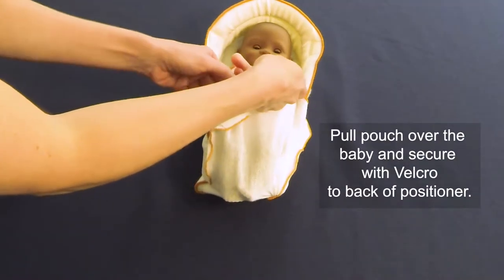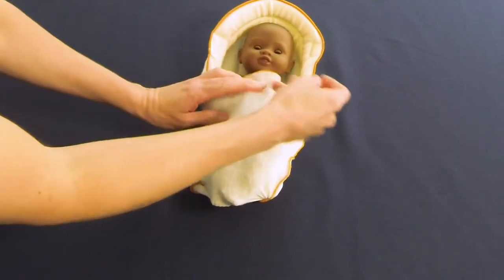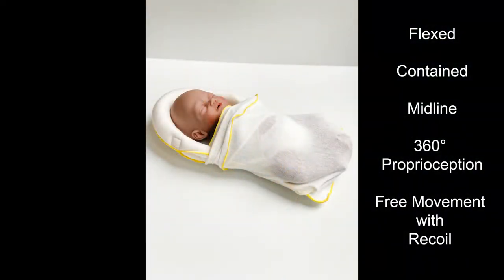Keeping the baby's legs flexed, pull up the pouch around the baby and attach the Velcro strips to the Velcro on the back. The Rulite provides all five key tenets of neurodevelopmentally supportive positioning.